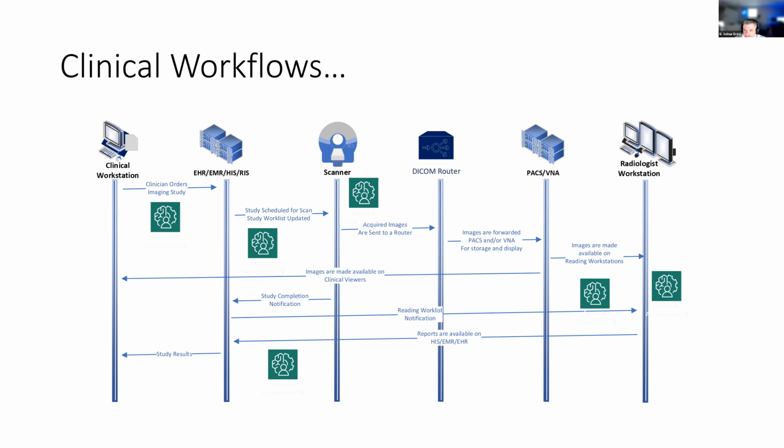Yes, it's great, but in a clinical setting, once the algorithm starts executing, it needs to be capable of receiving data in standards such as DICOM, or producing output in standards such as DICOM SR, HL7, FHIR, and so forth. With that in mind, the idea behind MONAI is to fill that gap and make things deployable in settings such as we're discussing here.